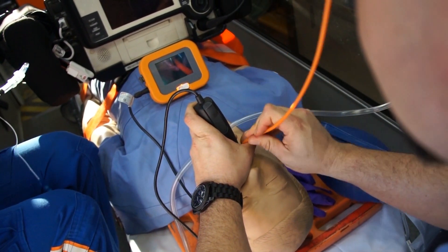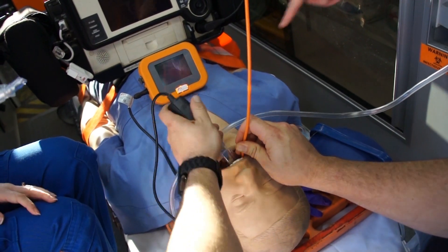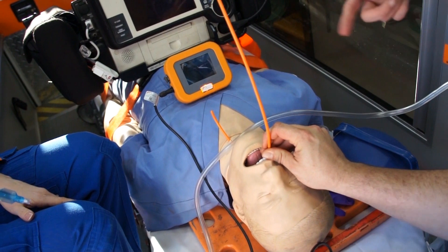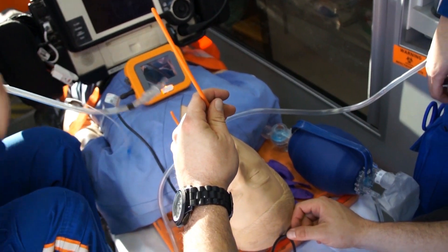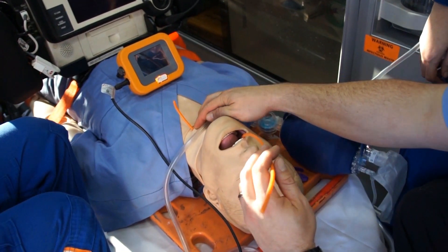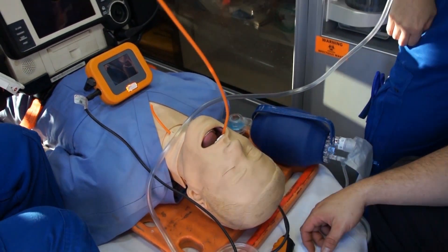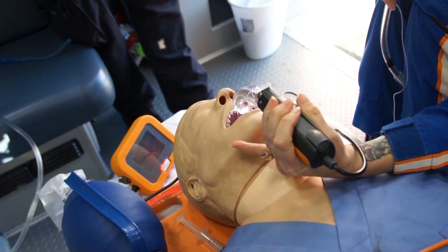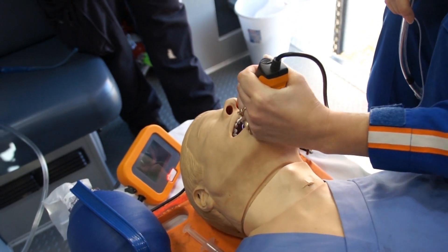You're supposed to be able to — oh, I'm supposed to leave that in, right? Yeah, it was just funny because we know we're in the right spot. Just one hand, just drop it in. There it is.